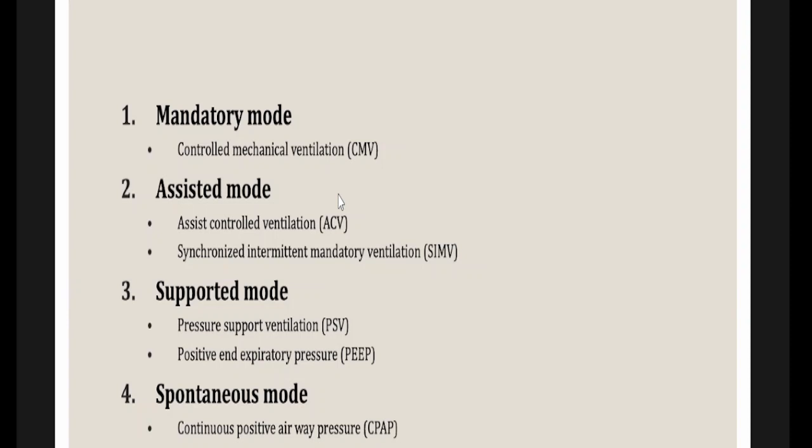So then you have the assisted modes. In assisted modes, you have assist controlled ventilation or synchronized intermittent mandatory ventilation, which you will have seen very commonly, which is being practiced.